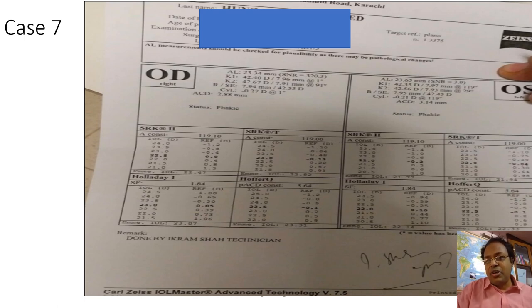The signal to noise ratio indicates the strength of the signal as a function of the noise. So you want a very high signal and not a very high noise. You can see in this eye, on the right eye, it is 320, which is very high. But anything below 50 is a very low signal to noise ratio, which is in the left eye. So before you look into the axial length and the K readings, can this data be relied on?